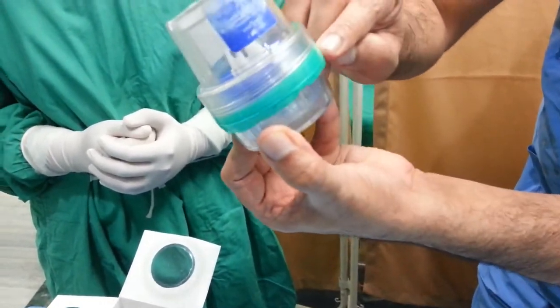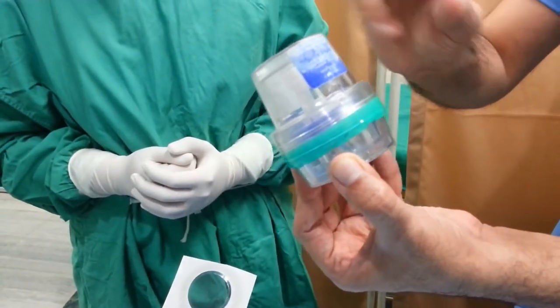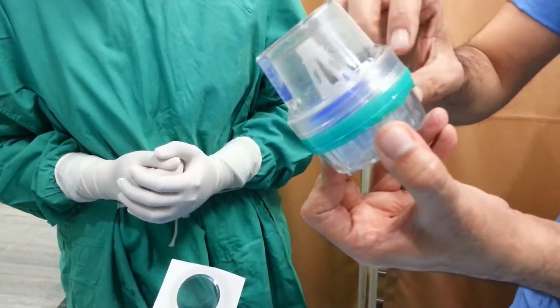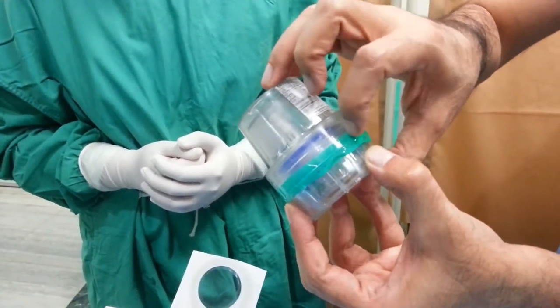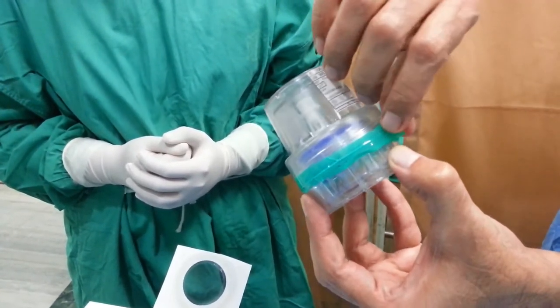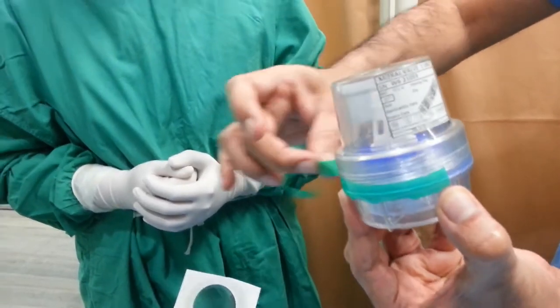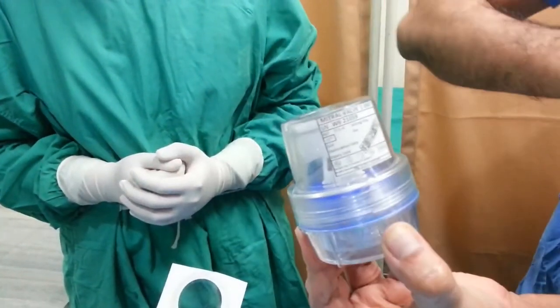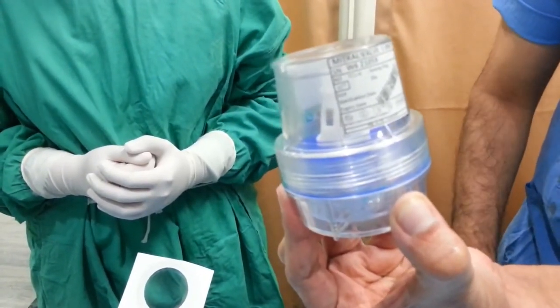And you'll see a tape. I've marked it in green color here, but actually it is a transparent tape. That tape has to be carefully opened, so you will find a point where it can be undone. So carefully with the knife, with the right hand, because the left hand is continuing to hold, this tape has to be undone. When this sticking tape is undone, the valve is still held in the left hand. Remember, you've not changed your hands.